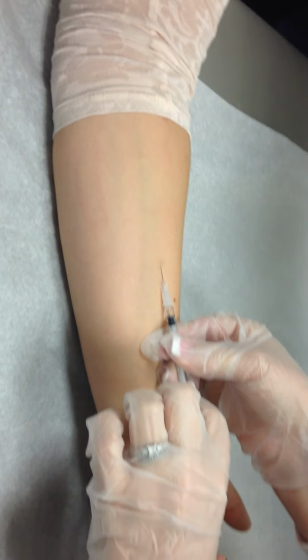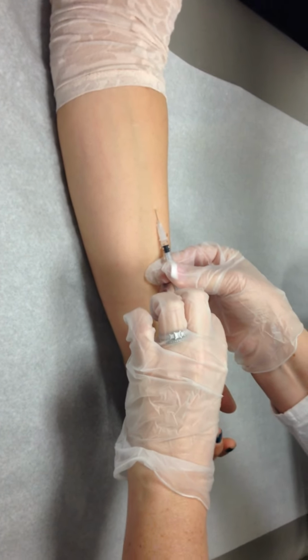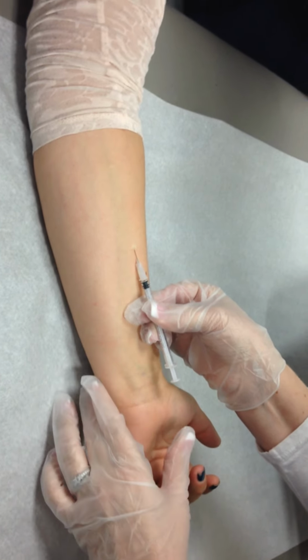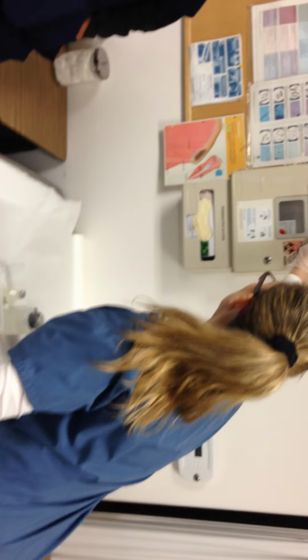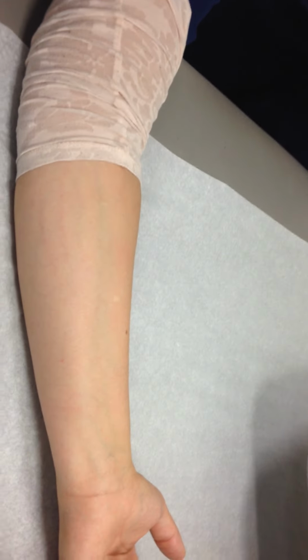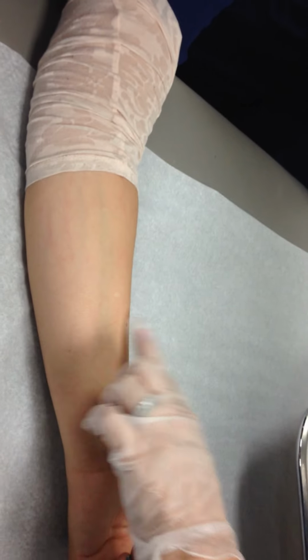Come over here. I'm going to push this plunger in nice and slow. I'm not going to go too fast. And I'm making that little bubble, which is called a wheel. And it's supposed to look like that. Take it out. Drop it. See that? That's what we want. That's a wheel. We want that. We want the medication right there, just like that.